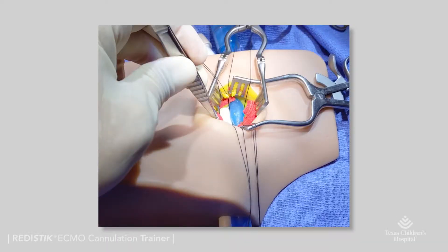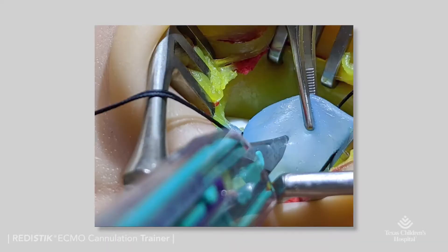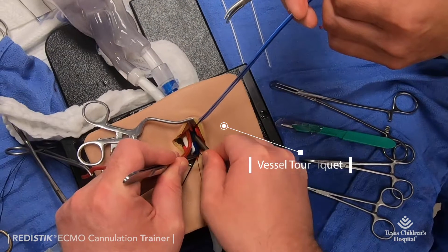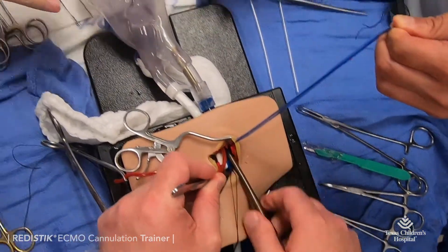The neurovascular bundle includes correct positioning, color, and feel of the internal jugular vein, carotid artery, and vagal nerve, allowing for accurate exposure, cutting, applying traction sutures, or tourniquets to control vessels for cannula insertion.